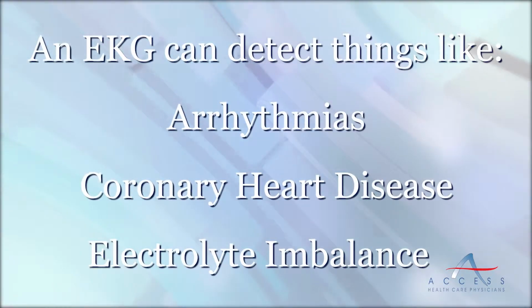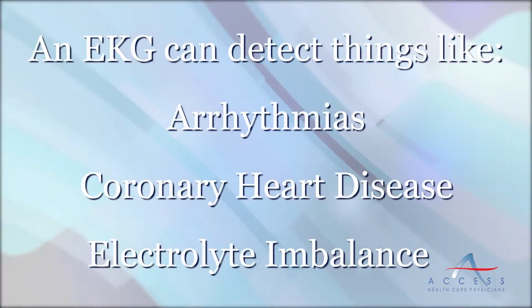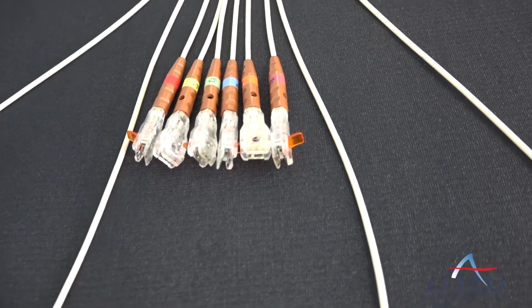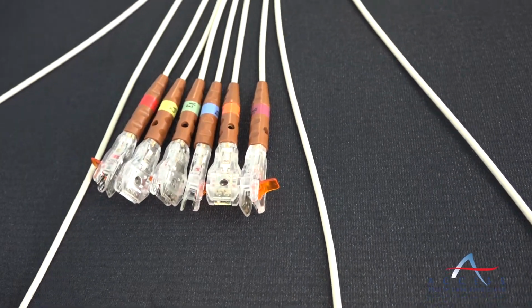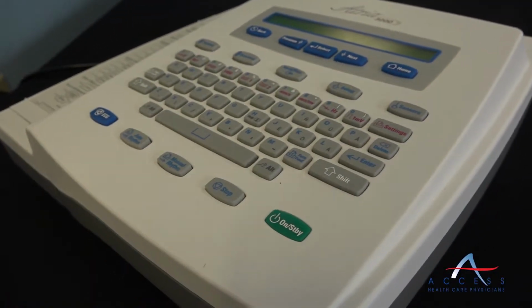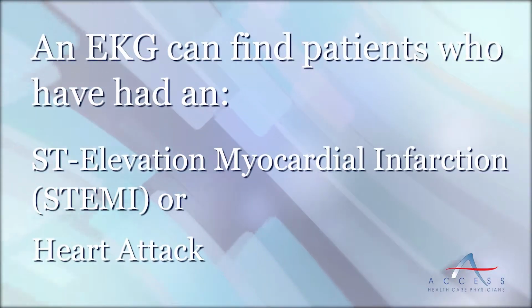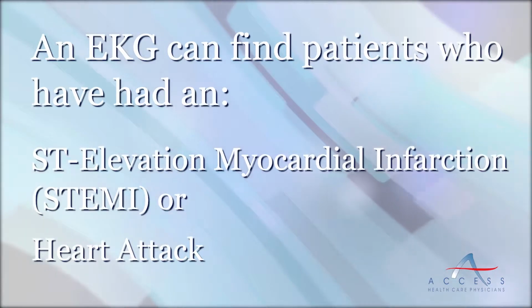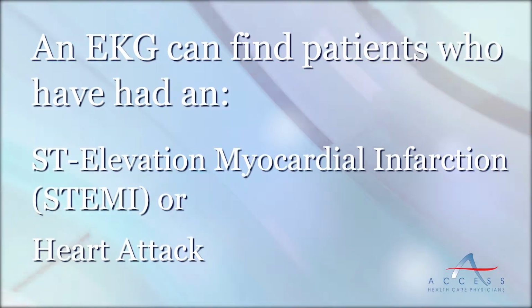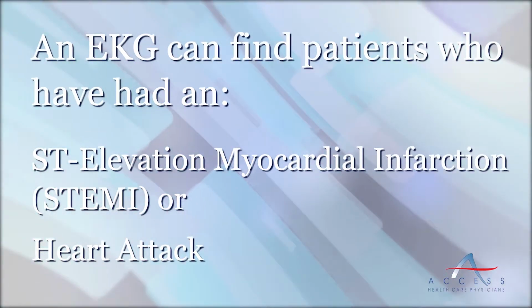An EKG can detect and monitor an array of health conditions, from arrhythmias to coronary heart disease to electrolyte imbalance. As of today, the 12-lead EKG remains the standard diagnostic tool. Its main purpose is to screen patients for possible cardiac ischemia. It will assist in quickly identifying patients who have had an ST elevation myocardial infarction, or STEMI, or a heart attack, and perform appropriate medical interventions based on those initial readings.